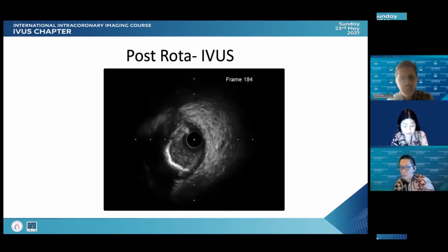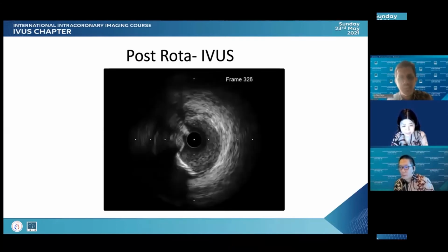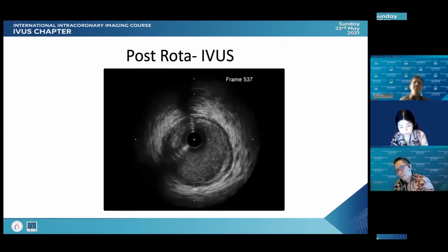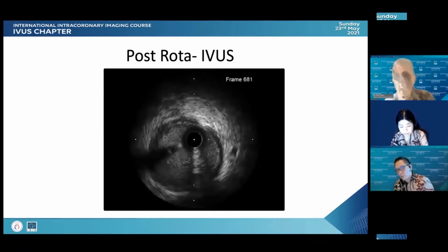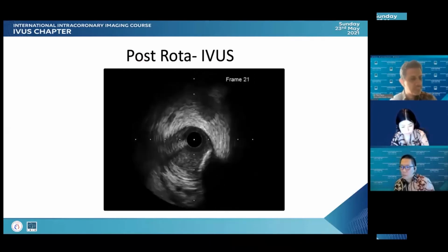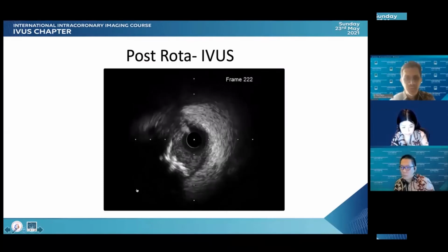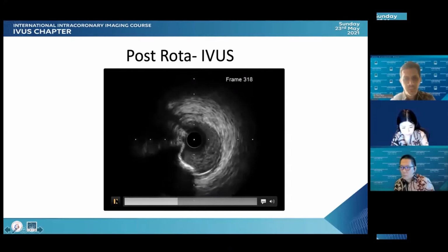From the circumflex. Now you pass the IVUS into the circumflex. Yes, any idea? Should we start the stent? Okay, so I think that's a very good picture, meaning that there is a very clear reverberation and a polished surface, which is a concave shape. So let's go a little by little. So this is calcium. Okay. Go ahead.